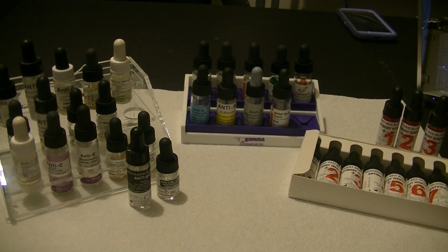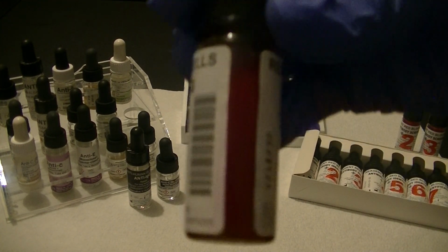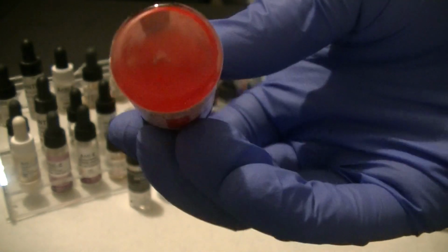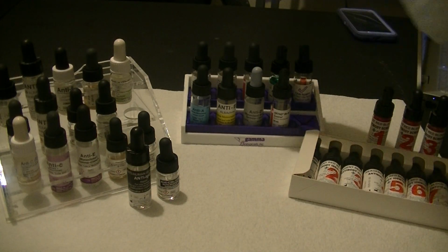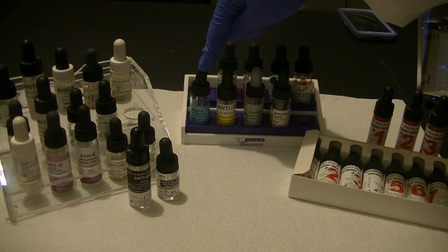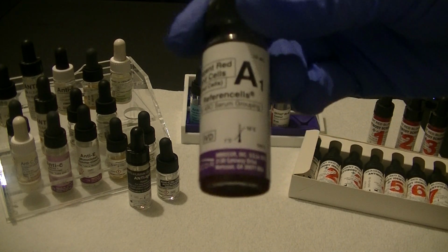The third type of reagent we use are known as reagent red blood cells. And so you can actually see that reagent red blood cells are bright red. And these bright red cells are so bright in their color because it is a 3 to 5% suspension of red blood cells in a saline solution. So when we type a person's blood, we type their red blood cells using anti-sera to see if they have the antigens, but then we also test their plasma to see if they have the expected antibodies.